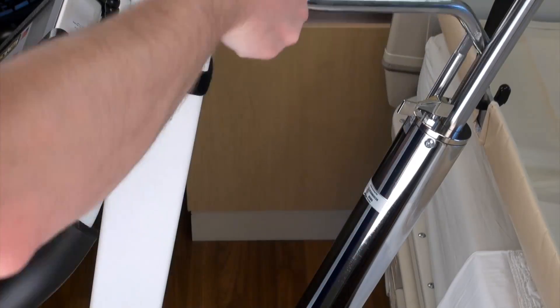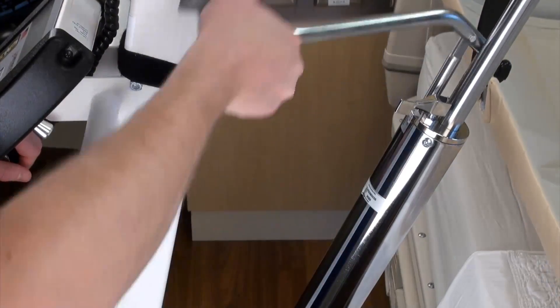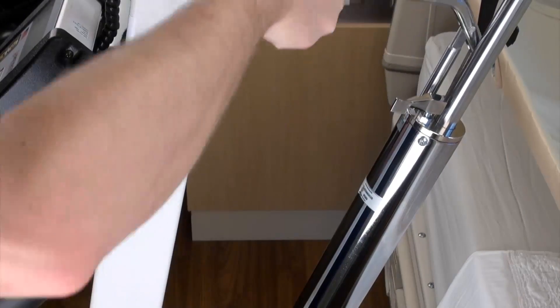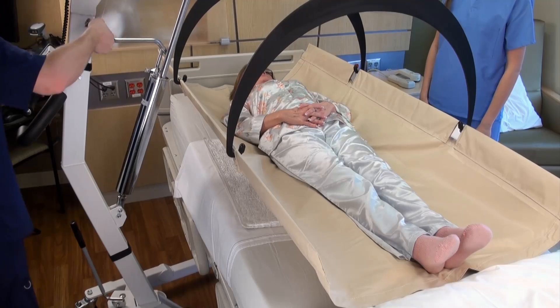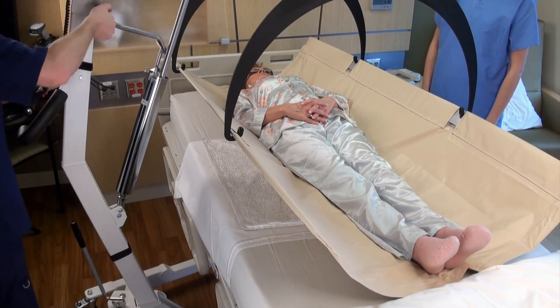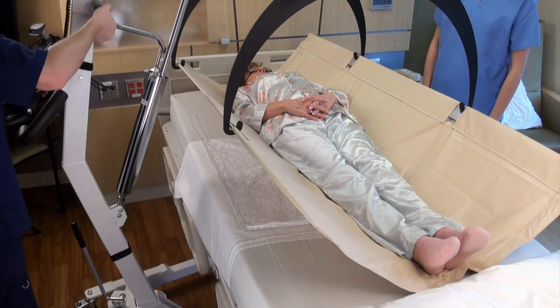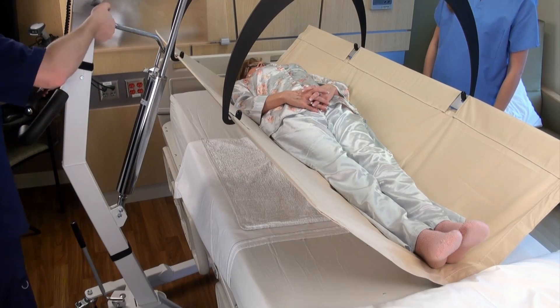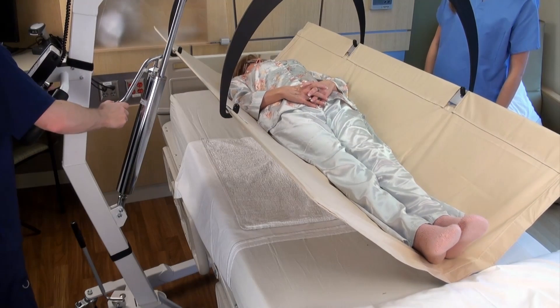Ensure that the valve is closed and begin pumping the handle with slow strokes of even pressure to gently raise the patient from the bed. Monitor the display of the indicator as the patient is being raised and continue pumping until the patient is about an inch or so above the mattress. Make sure that no part of the patient or the stretcher is touching any part of the bed or mattress for an accurate reading.